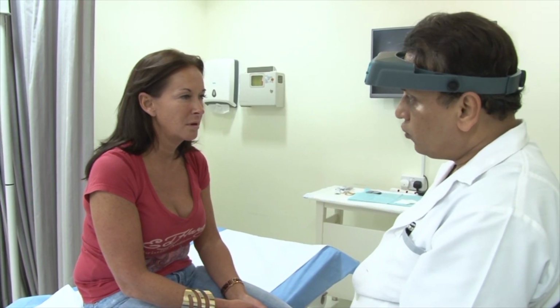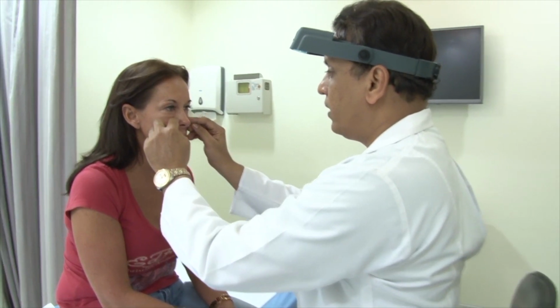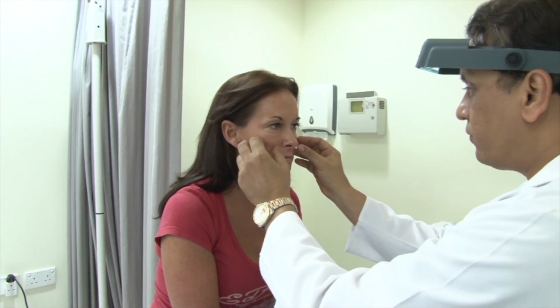So I think what we'll do now is we'll put some filler in this area here. I'm going to use filler called Voluma. The advantage of this is it stays longer, and it gives a volume effect that will lift the part of the mid-face. After this, we'll see how this looks. If need be, then I'll give you a different filler which is not as thick as Voluma, like a Teosyal Deep Line in this area to fill that out. And then we assess how it looks. You see how it goes.